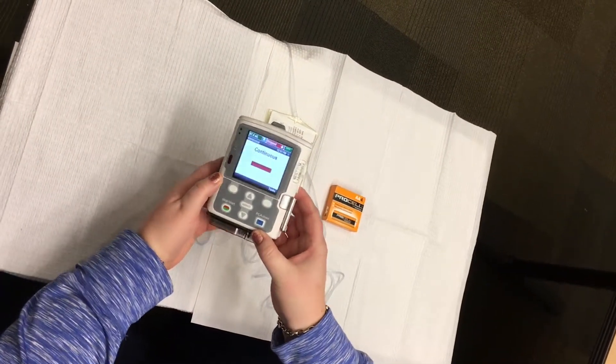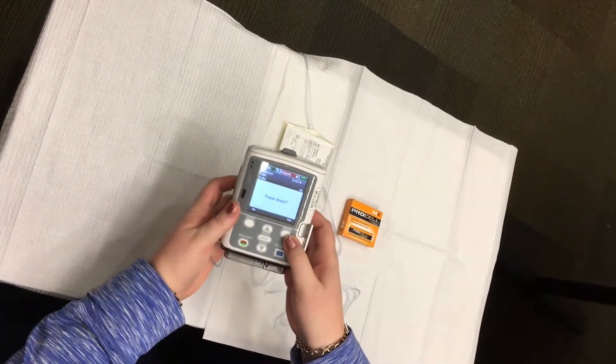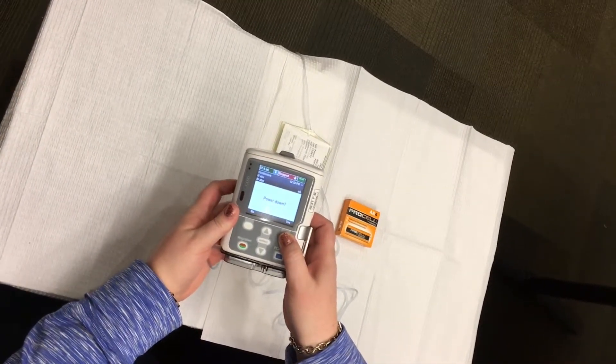Power down the pump by pushing the on/off button on the right side of the pump. The screen should now show 'power down.' Push the white button below yes.